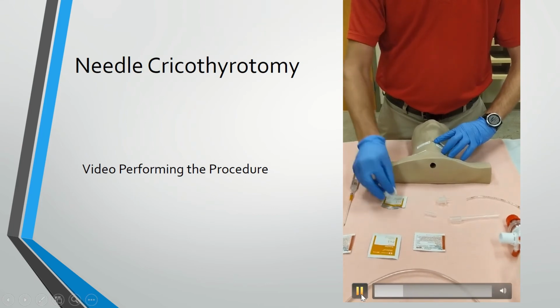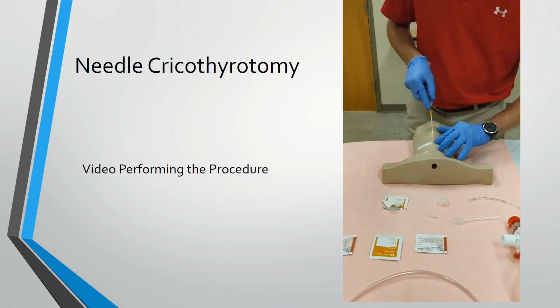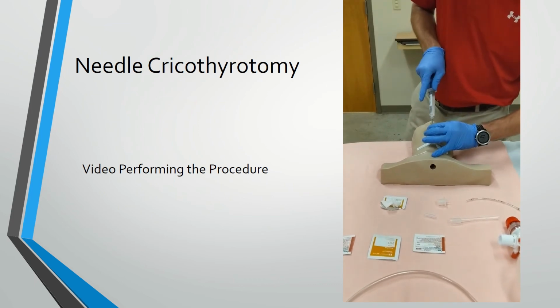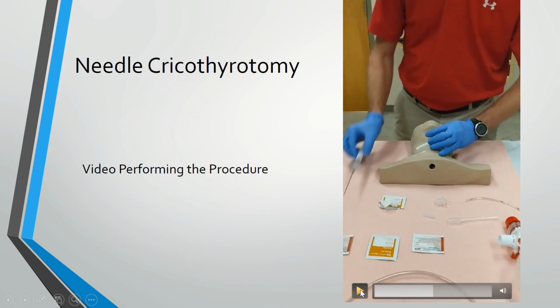There, I find my landmarks. I have my cleaning device. I clean it. As you can see, I've got it in my dominant hand. I find a 45-degree angle. I slide that catheter over the end. I puncture it. I withdraw it.